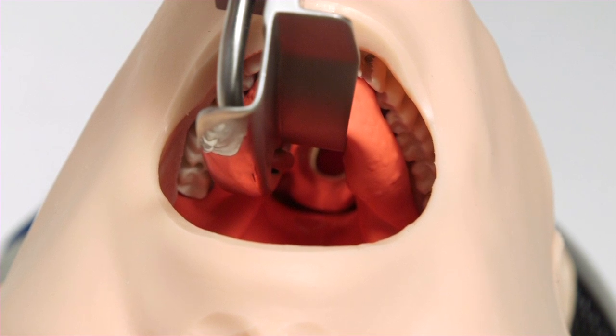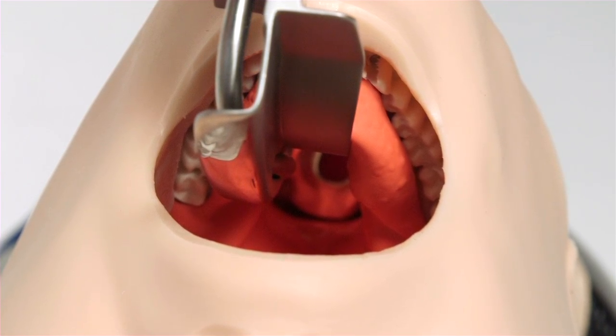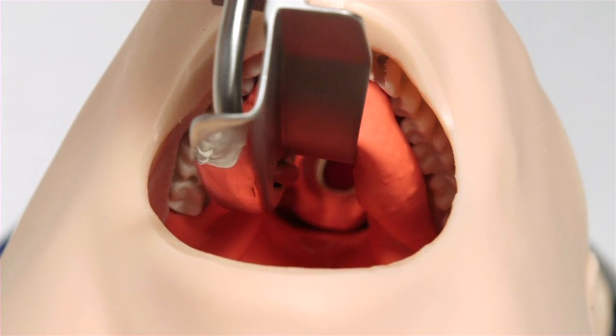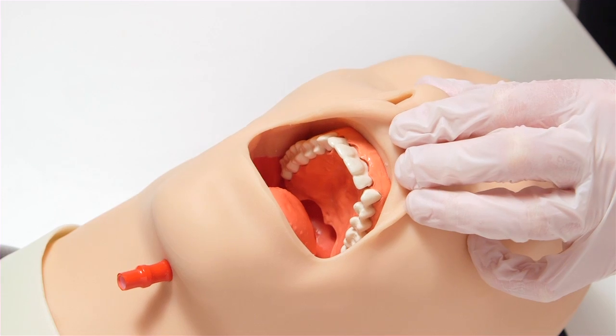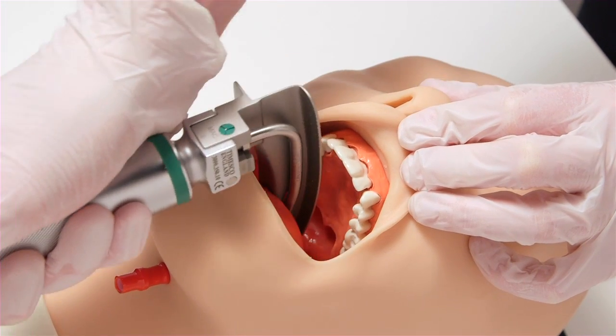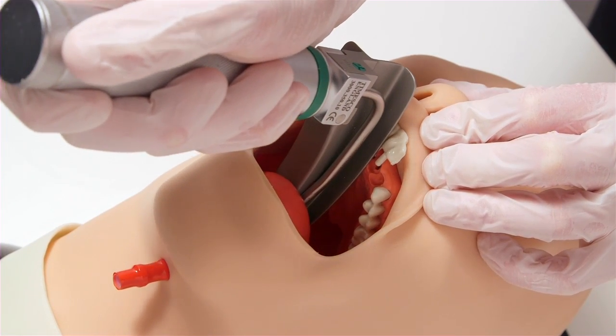The Trucorp AirSim Airway has been accredited as a certificate for 20,000 intubation cycles without fail, emphasising the product's durability. This mannequin offers the option of breakout teeth to illustrate best practice in direct laryngoscopy.